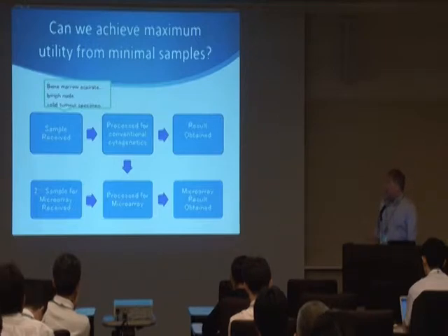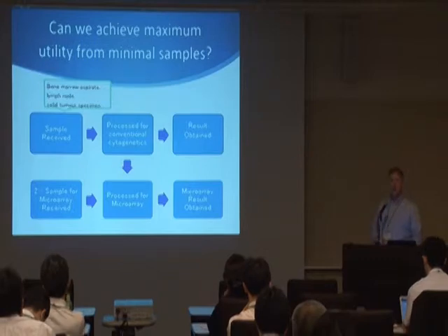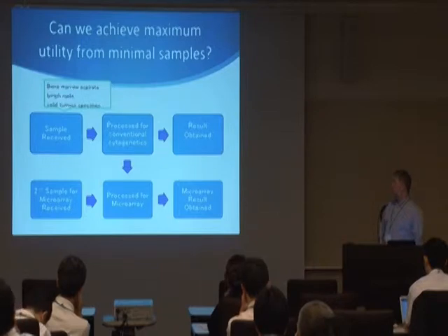But when we started this pilot project, actually a few years ago, we were more concerned about adding microarray technology to our regular routine clinical processing, because we quite often had problems with samples where we didn't have a sample that was growing, so we had a failed culture, or we couldn't get live tissue from a patient, so we needed to make sure that we could actually perform some kind of testing.